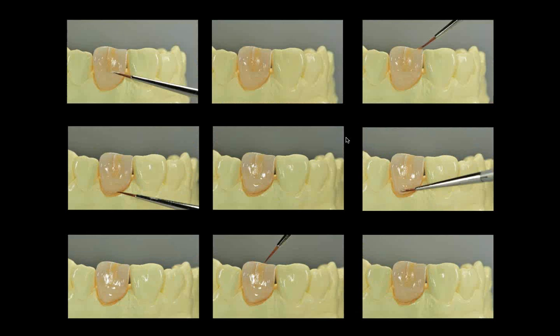And like I said, if you want to stain it, you can go ahead. You can use the new accent stains, and you can modify whatever you want on these crowns. Just a reminder, if you put a brown line, you always have to put something white next to it. If you want this area to look out a little bit, you have to put a little bit of white color here.